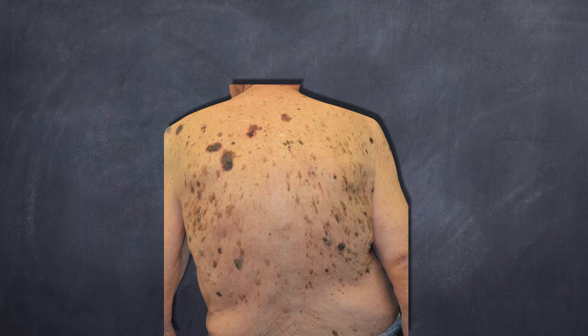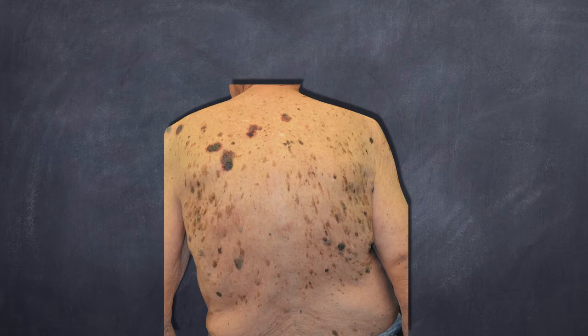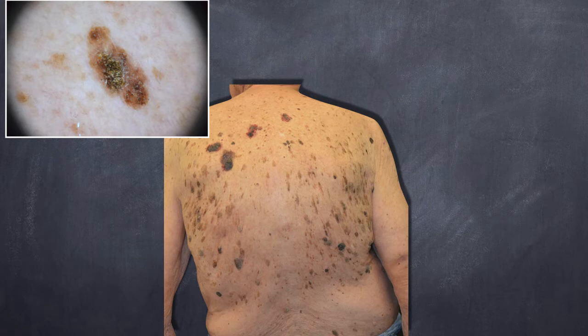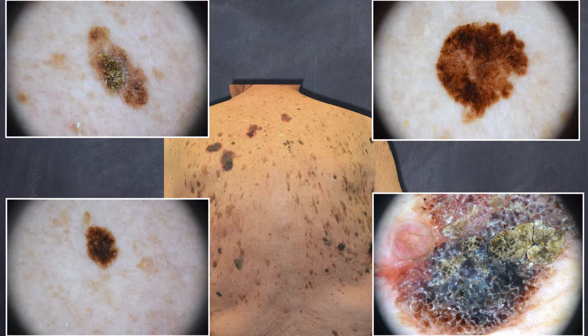First example: this is a patient with multiple seborrheic keratoses, and as you can see some of them have also been subjected to cryotherapy. The patient came because of the cryotherapy, complaining of erythema and some itch. Since this was the first time we saw the patient, we started checking the other seborrheic keratoses — the ones not subjected to cryo — and we took dermoscopic photos of several lesions.